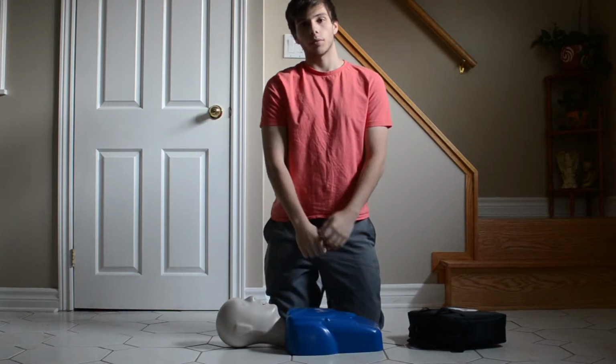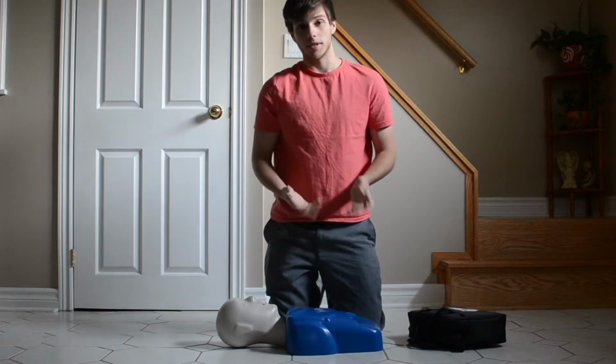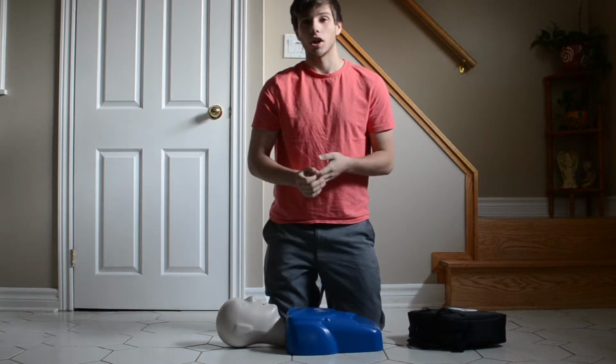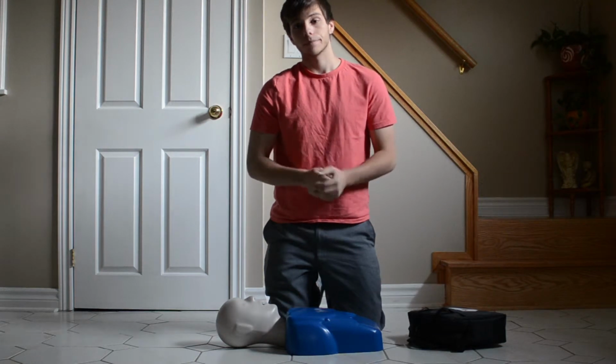I'm a first aid instructor with the Red Cross and I'm also an emergency medical responder. So today I'm going to be teaching you how to perform CPR and use an AED on an unconscious patient with no findable pulse. Okay.